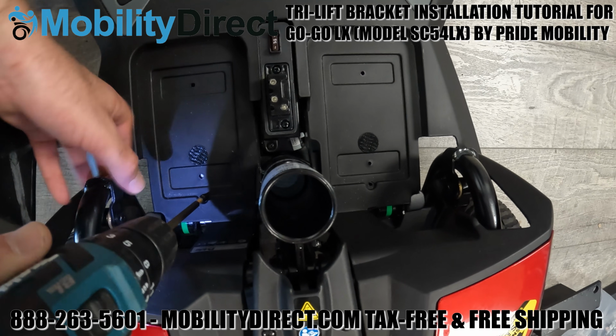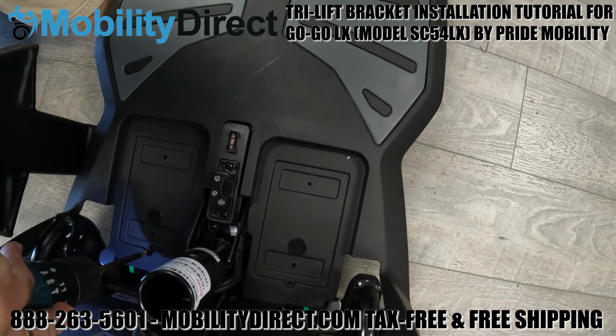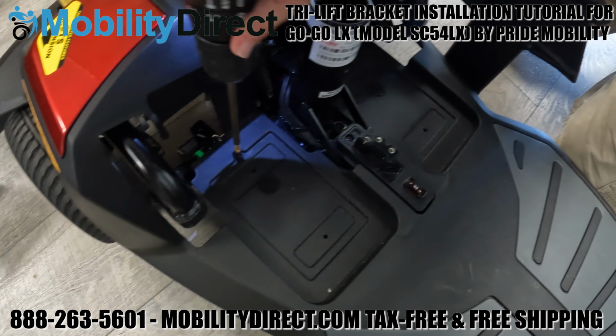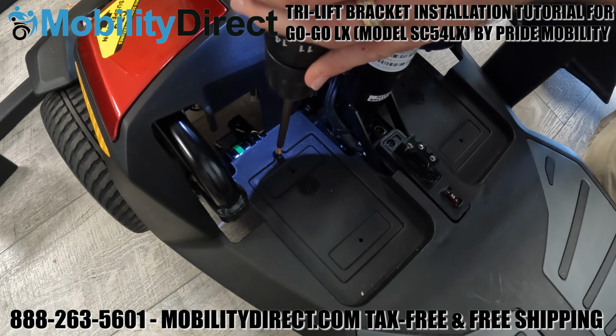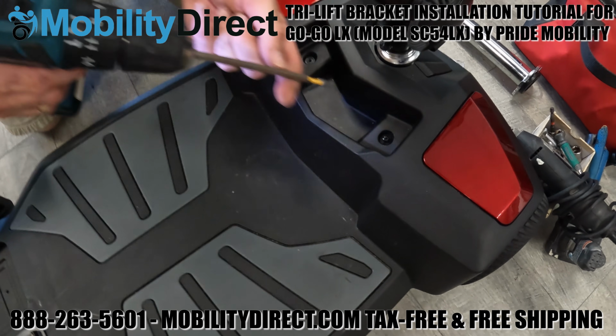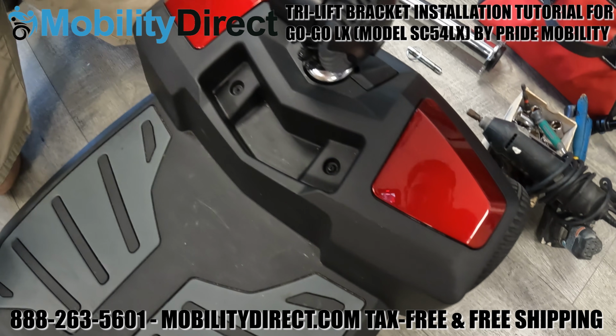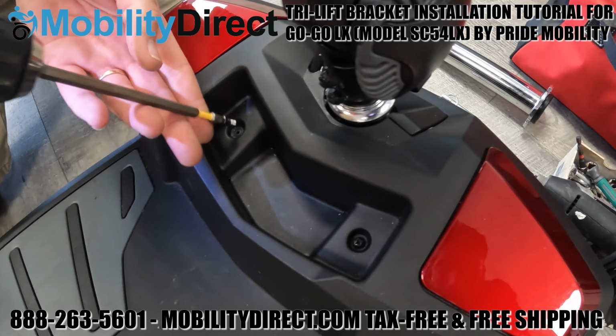Start off with those 2 screws, get them in there. Don't over tighten in this part here. You could crack the floorboard, which is made out of a plastic material, and just get it in there nice and snug. So we're reattaching the 2 screws in the front now. And basically the installation of the bracket is complete at this point. We just need to reassemble the scooter.